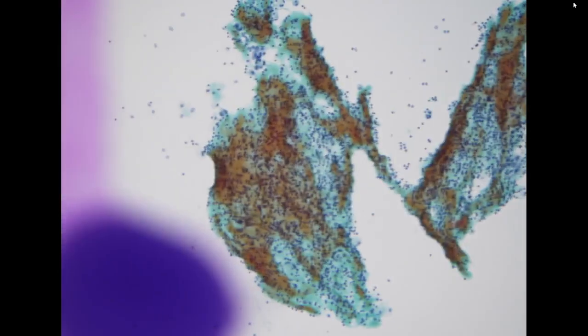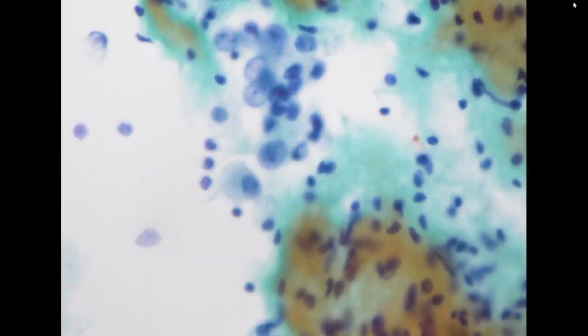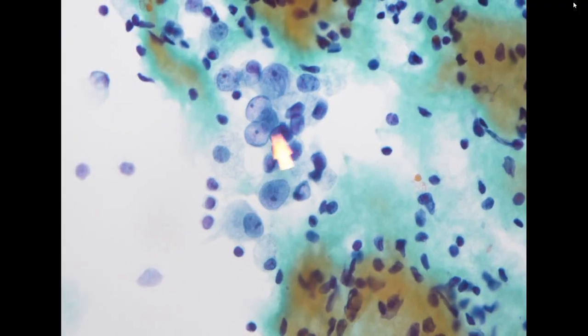The cellularity is not very high, but from here to there you can definitely see some clusters of cells, suggesting glandular differentiation with glandular arrangement. So this is positive, compatible with recurrence of the primary lung adenocarcinoma.